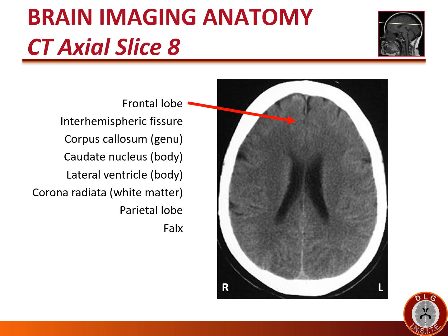The frontal lobe continues to be seen in the ventral aspect. We still see the black line of CSF between the two hemispheres — the interhemispheric fissure. Once again we see the band of white matter connecting the two hemispheres — the corpus callosum — and specifically the genu anteriorly. At this level one can appreciate the tail shape of the caudate nucleus, with the body of the caudate easily seen running along the lines of the lateral ventricle.